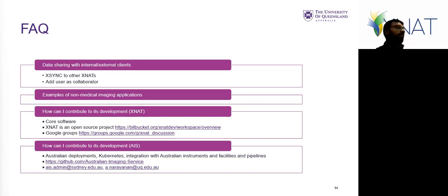Unless there's any questions, I think I'm done. I think you had Aspera written somewhere. Sorry? You had Aspera written somewhere. Oh, so it has Aspera options. It's not something we've enabled or we use. We haven't got a request yet, so it's not something we've looked into either. But it has some support in the system.